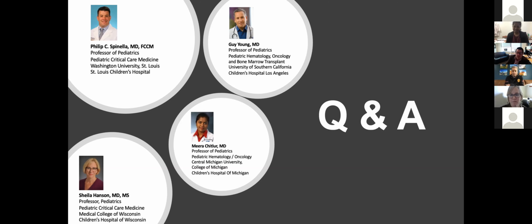Right. Just my quick comment, and then we'll move on. As you inferred, Sheila, the anti-10A is really only telling you the amount of inhibition that's occurring at 10A. And our patients start with different thrombin and fibrinogen function when we start anticoagulation. So if patients are incredibly prothrombotic, like some of these COVID patients, an anti-10A of 0.5 may still leave them hypercoagulable and still at risk of thrombotic complications, whereas a patient who doesn't have COVID but just needs to be on anticoagulation for another reason, an inhibition of 0.5 may bring them down to a hypocoagulable state.